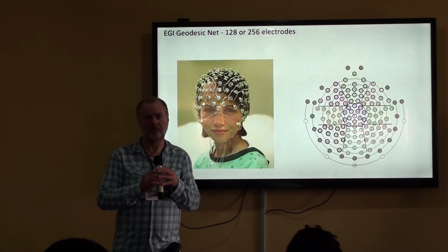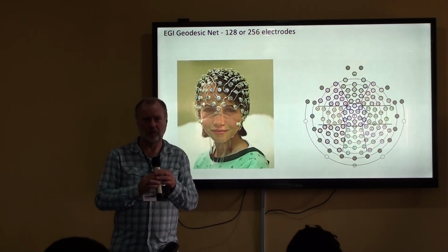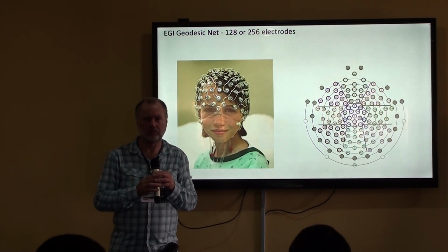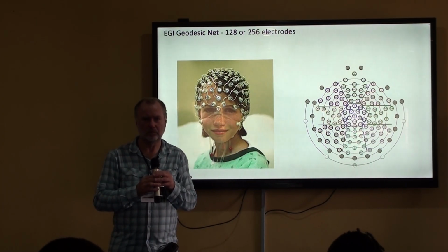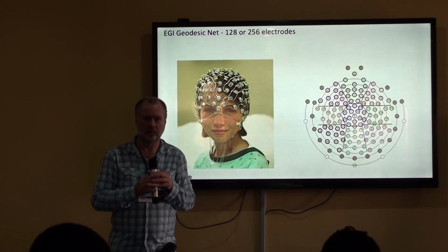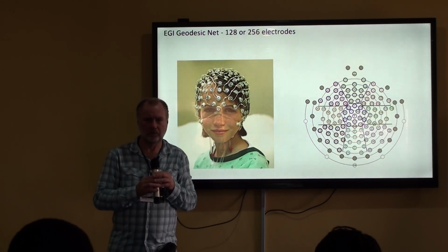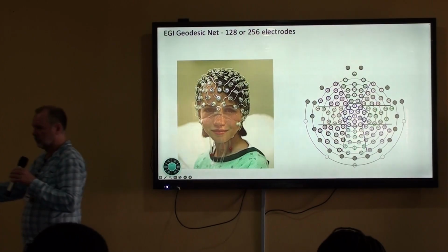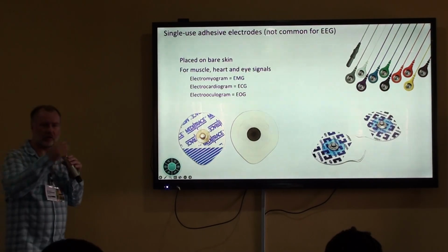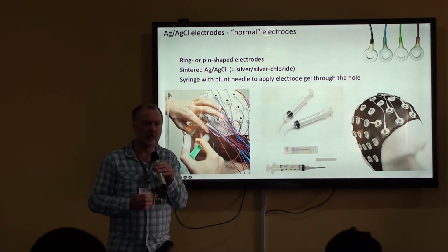Okay, my question is on ECG. Yesterday when we saw the speed page, I realized there was a sheet from EEG, with the ECG attached to it at the bottom part of it. So I want to know, are there specific electrodes that record the heart activity attached to the ECG sheet? We would typically use these electrodes to record ECG.